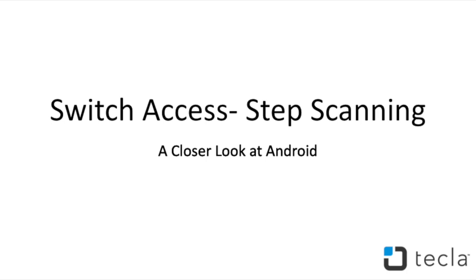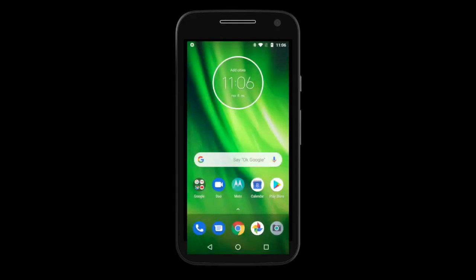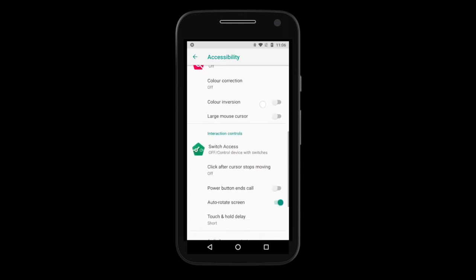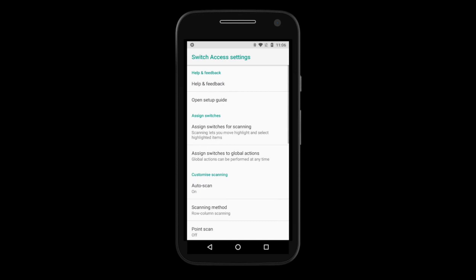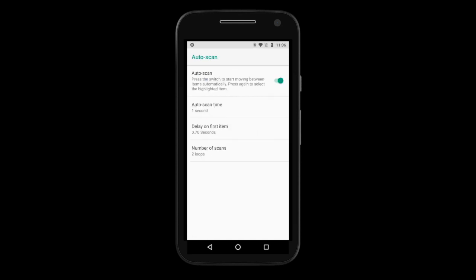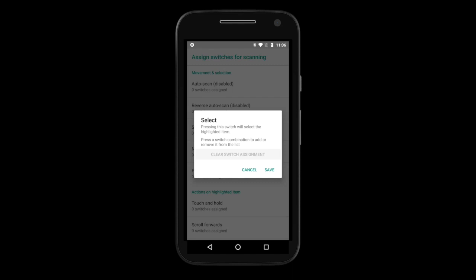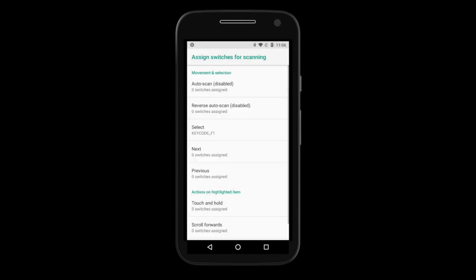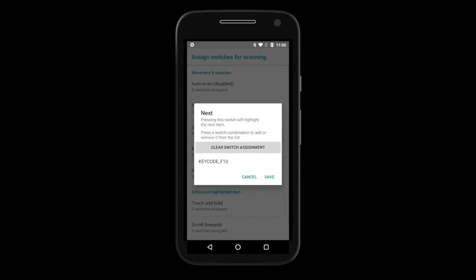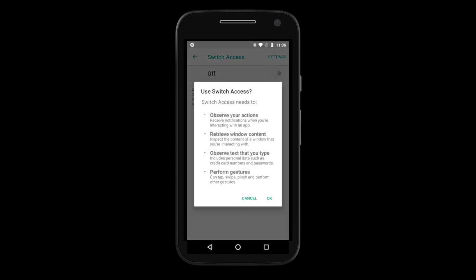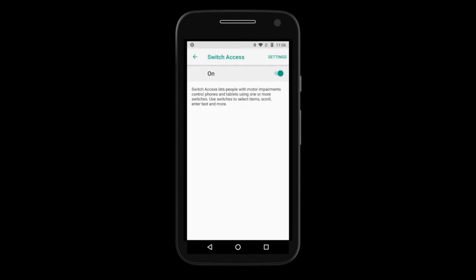Second, let's discuss step scanning. To begin, go to Settings, Accessibility, then Switch Access. Next, move into Switch Access Settings. We need to make sure Autoscan is off — tap Autoscan and disable it if it is on. We can now assign the switches connected to Tecla E. Go to Assign Switches for scanning. In the next screen, press the switch you'll use to select. Once the switch press is registered, tap on Save. You can go back to the Switch Access main page and enable Switch Access. Once you activate it, you will see a menu button at the top of the screen and elements will be scanned when you press the switch assigned to next.